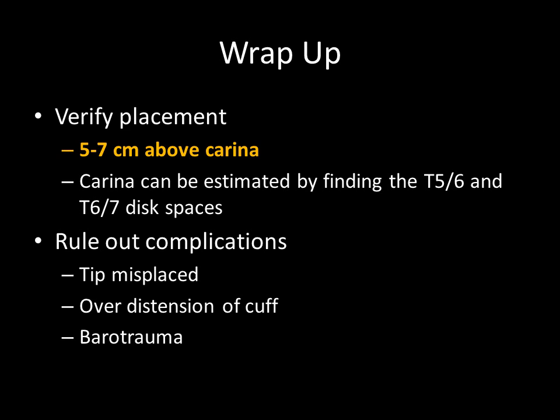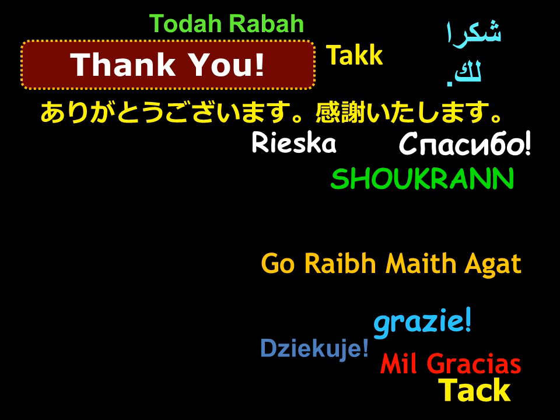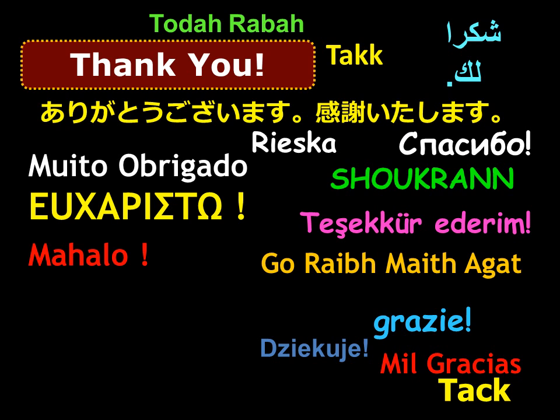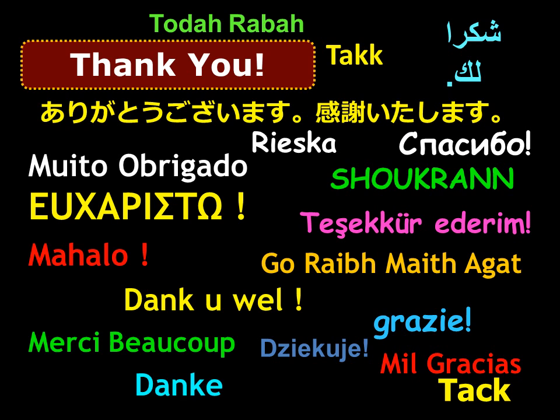ET tubes are very common in the ICU. The chest x-ray is used to verify placement — you want to verify that the tip is within 5 to 7 centimeters of the carina, which can be estimated by finding the T5-T6 and T6-T7 disc spaces. You also want to rule out other complications such as over-distension of the cuff and barotrauma, as shown in the previous examples. This is the end.